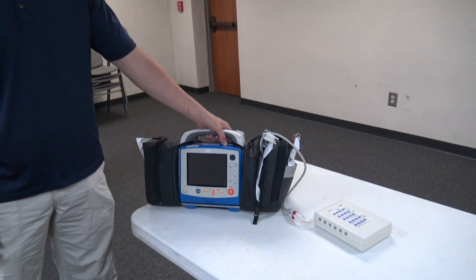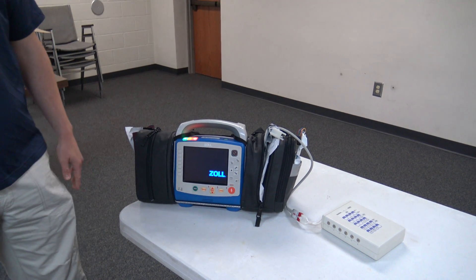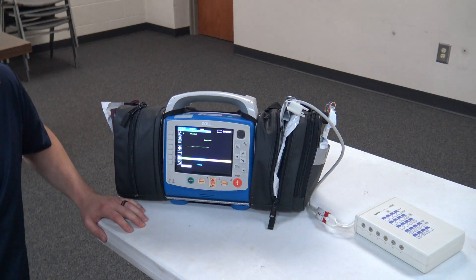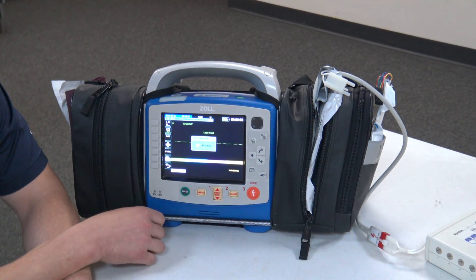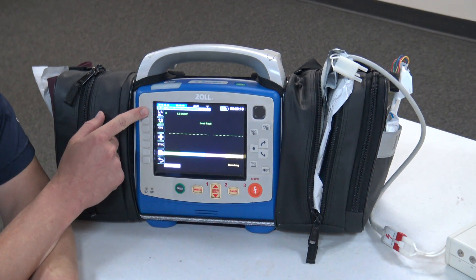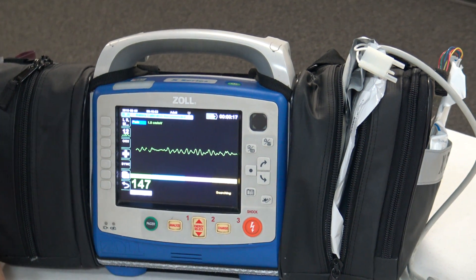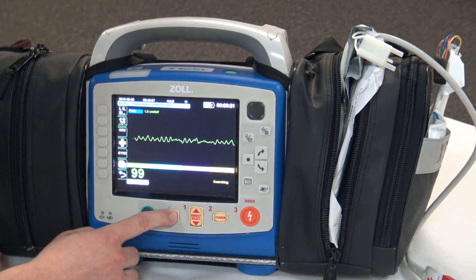There are a couple of different thoughts out there, but basically if we get this thing turned on and we get the pads put on the patient, the first thing you'll notice is that we have a dotted line — we don't see what's going on. In order to see what is in pads mode, we have to go to this top soft key up here and cycle through until we hit pads. Now once we have the pads on, we can go straight to AED mode by hitting Analyze Rhythm.